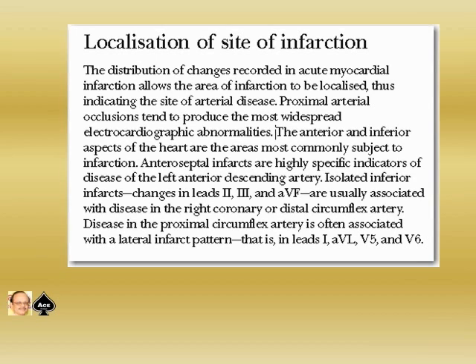Isolated inferior infarct changes in leads 2, 3 and AVF are usually associated with disease in the right coronary or distal circumflex artery.